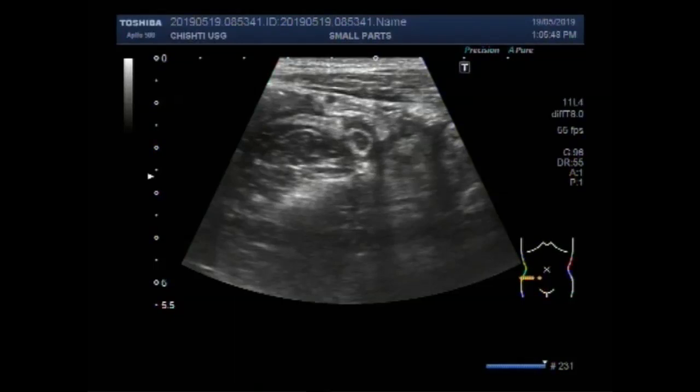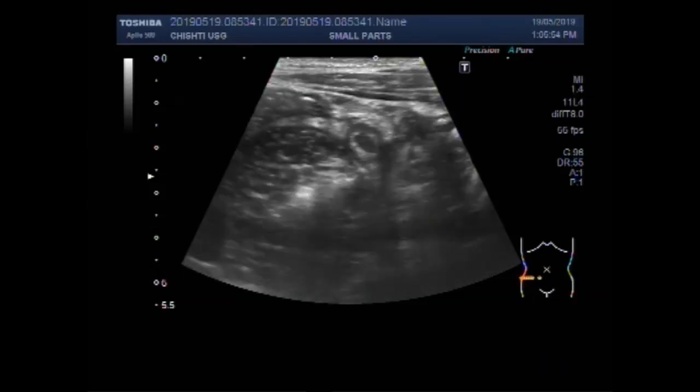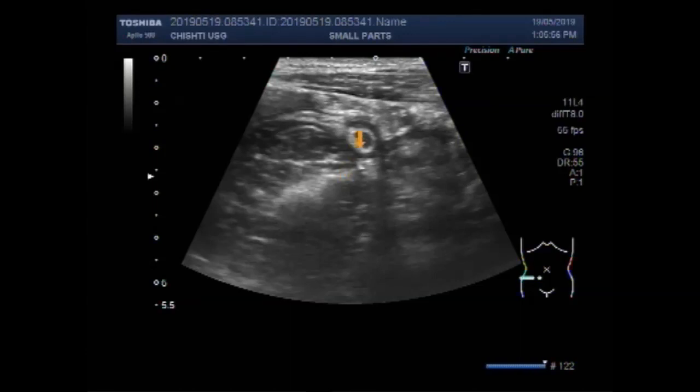Dear viewers, I hope you are all fine. This ultrasound video shows the art of probing for focusing the acute appendicitis or inflamed appendix.